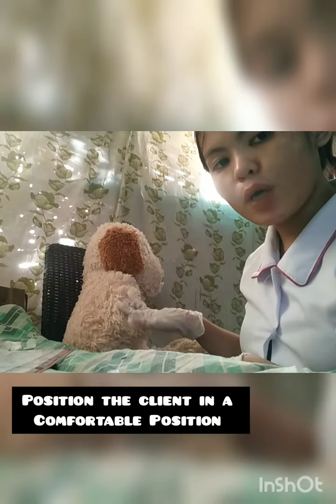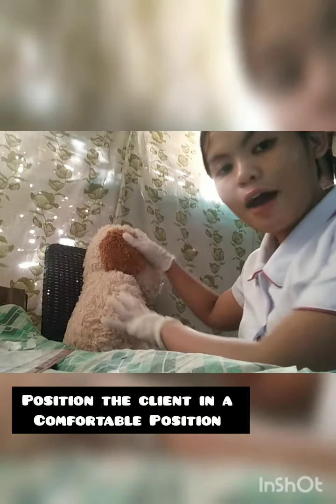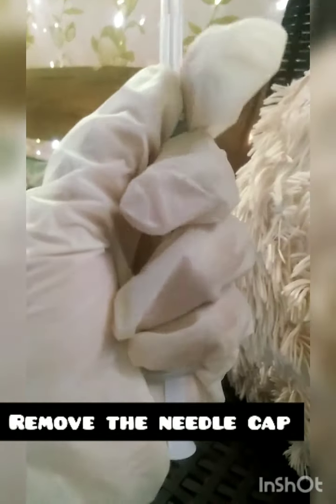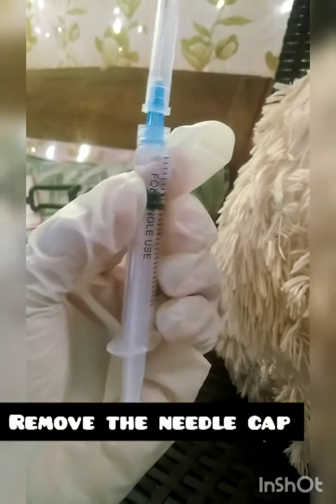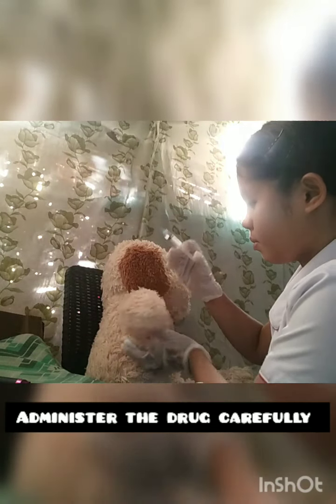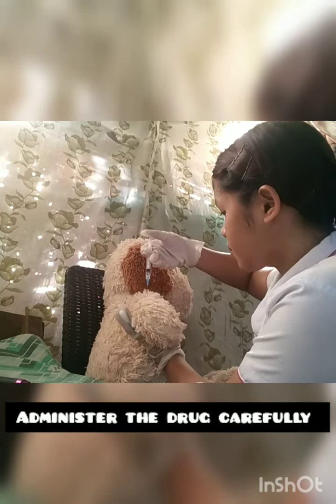Since I am going to administer the medicine into the deltoid muscle, we have to let the patient sit. Uncap the needle. Administer the drug at a 90-degree angle.